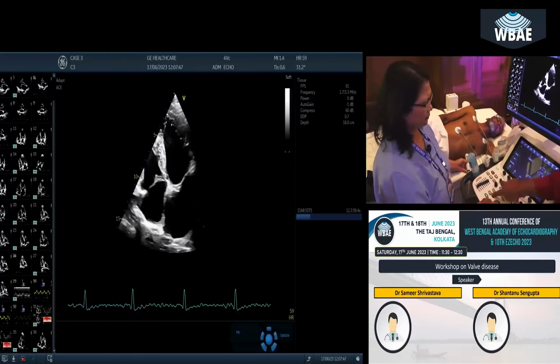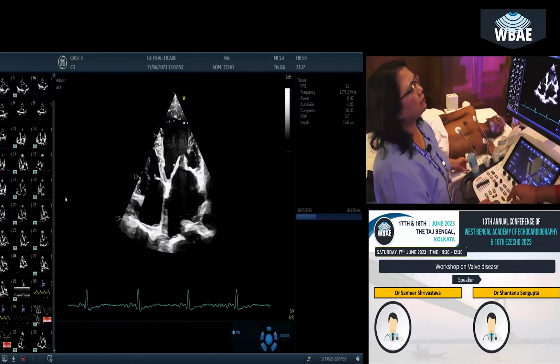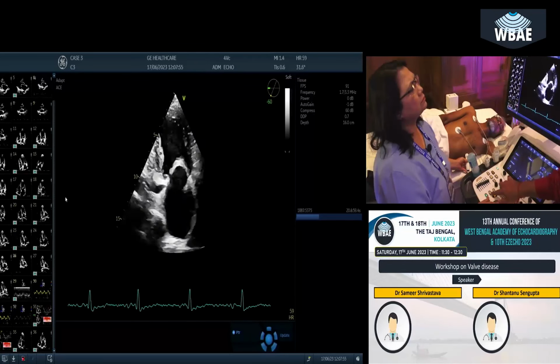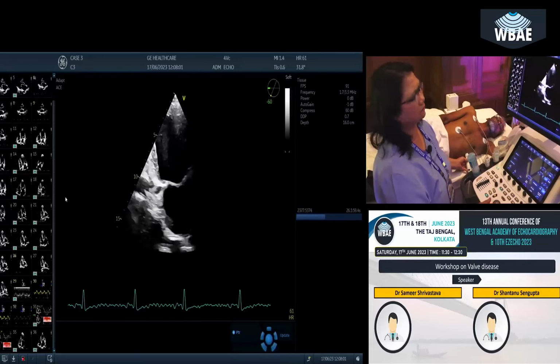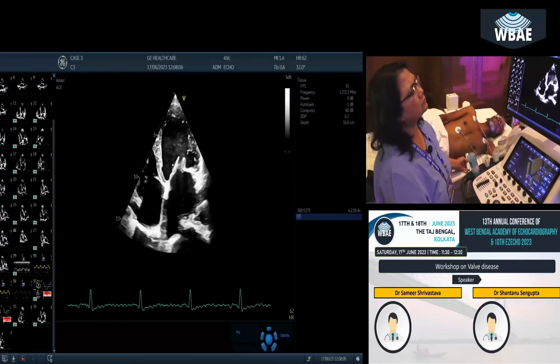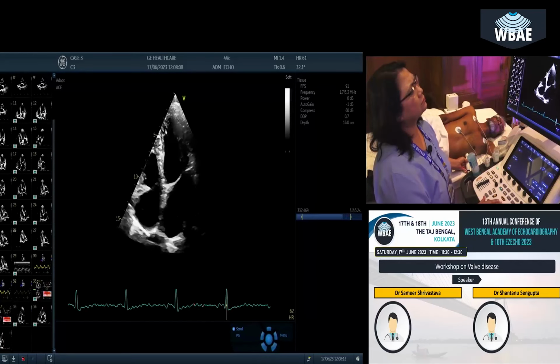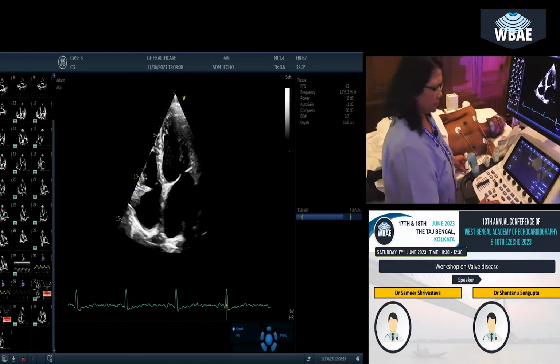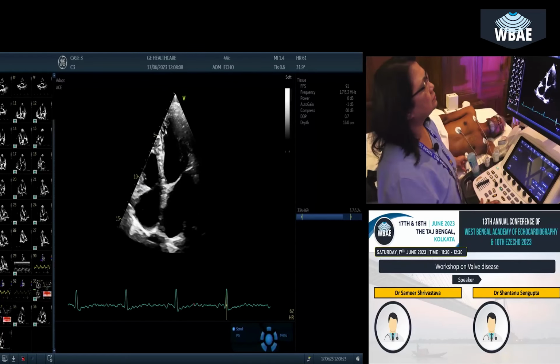Let's quickly do it, and we start from one annulus. And there is a catch point in that. Yeah, I'm coming to that. Difference should be less than 10%. Yes, we are coming to that. You are correct. Just freeze it. She's trying to take, I think, a 2-chamber view. It's an MS patient, no? I think LA volume, 2-chamber. You got a 2-chamber view, I think.